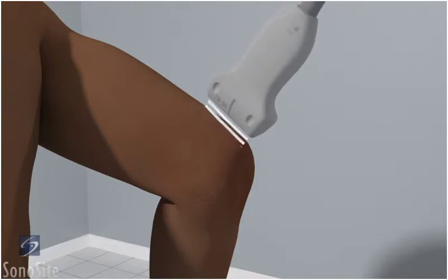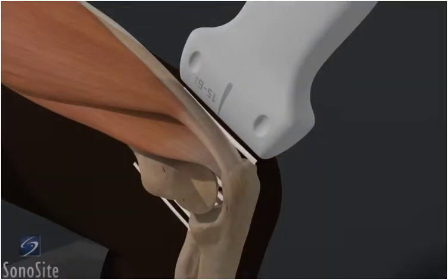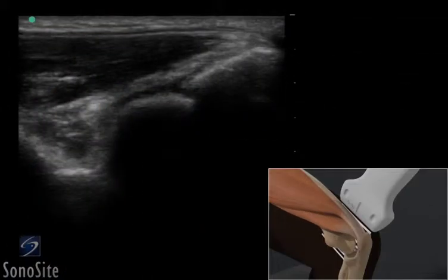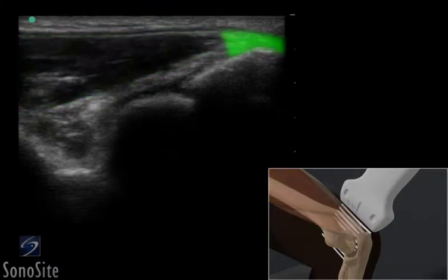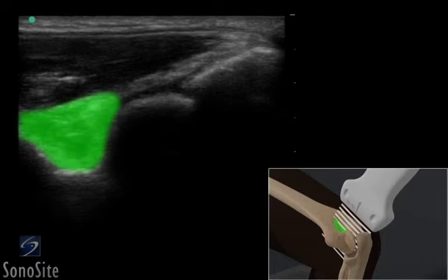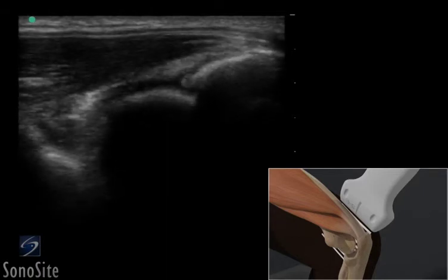The transducer is placed over the posterior elbow in a longitudinal fashion with the orientation marker directed toward the patient's head. The distal triceps muscle appears as a hypoechoic striated structure which transitions to the fibrillar triceps tendon. The olecranon is seen as a bright, hyperechoic, curved structure. The posterior fat pad can be seen as a complex, hyperechoic area overlying the posterior olecranon recess.